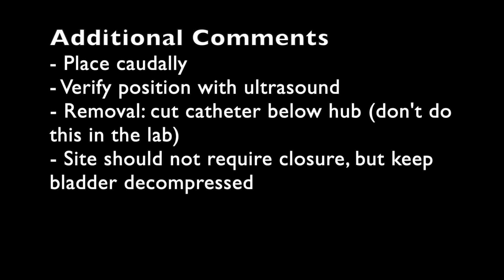Some additional points: with an obstructed urethra and a distended bladder, the bladder has a tendency to drift cranially within the abdomen. So when we are applying the catheter, we want to make sure that the catheter site is more caudal in the abdomen. We're going to gently apply caudal pressure and make sure that the bladder is in its natural, more caudal position. Ideally, we would like to verify the position of the tip of the catheter within the lumen with ultrasound.